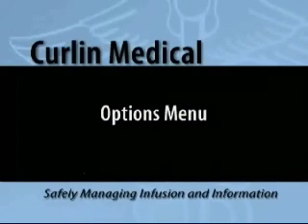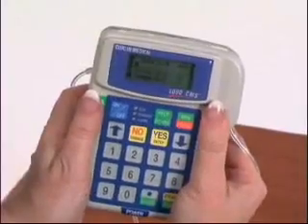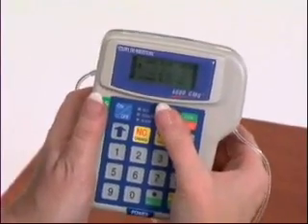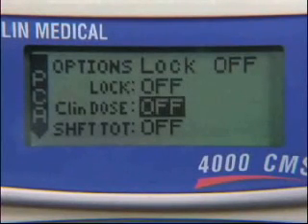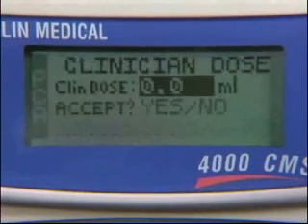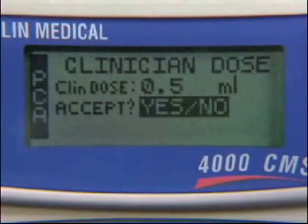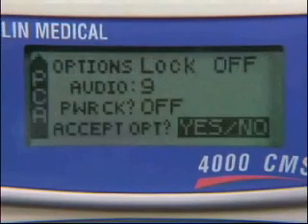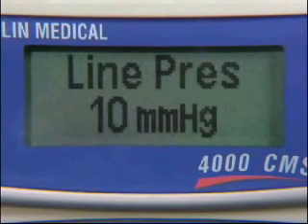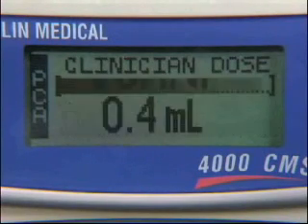Everything else you would like to do with the pump is found on the Options menu. To give a clinician bolus, note that the pump does not have to be paused. Press the Help Options button to pull up the Options menu. Use the down arrow button to highlight the clinician dose feature — the feature will read off. Press the No Change button to change off to on. Press the Yes Enter button to confirm on and enter the clinician dose feature. Enter the clinician dose amount, then press Yes Enter. Press Yes Enter again to confirm and exit the feature. Press the Yes Enter button to confirm the Accept option. The clinician dose will be administered, showing the amount being given with a bar graph advancing as the dose is delivered. The pump will beep when the dose is complete.